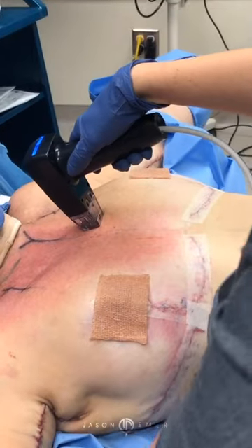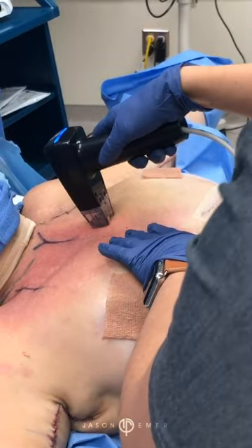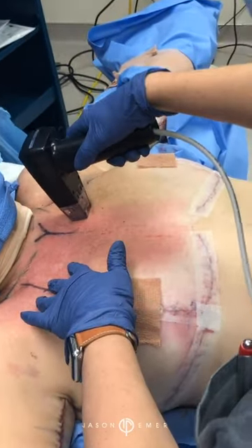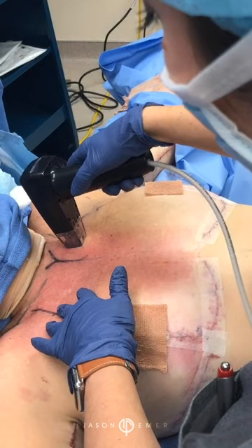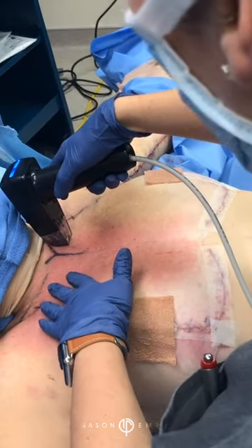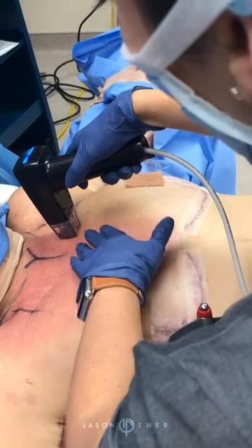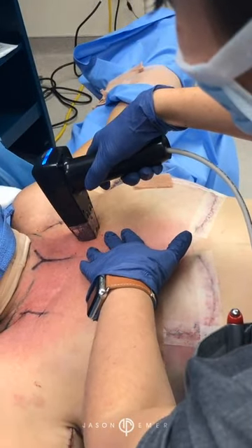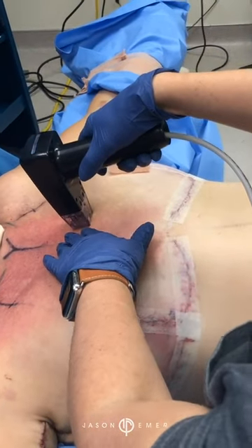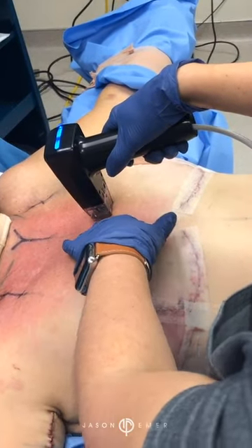You can see the skin response happening very quickly — textural pattern. She's going to have great tightening from this. Well, I'm going to finish up here. That is Morpheus. We can do this both in the office and in the operating room. Just topical numbing is enough for it. So that's Morpheus in a nutshell. Thanks, guys.